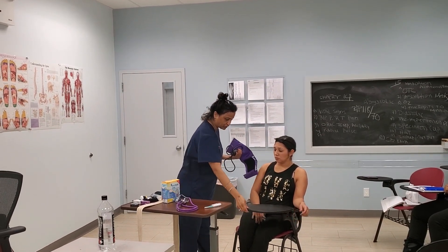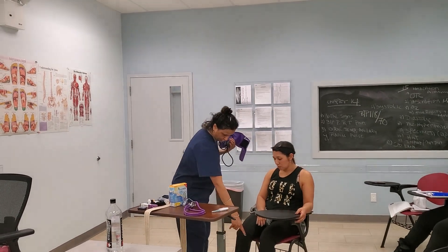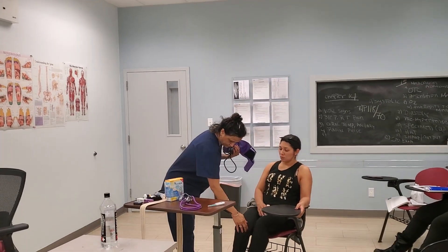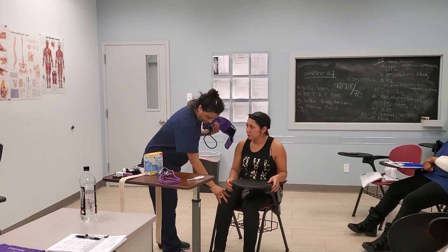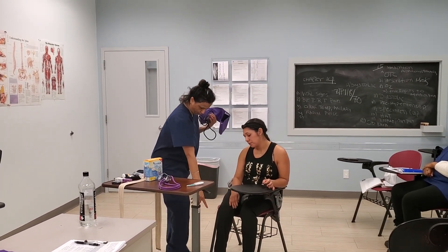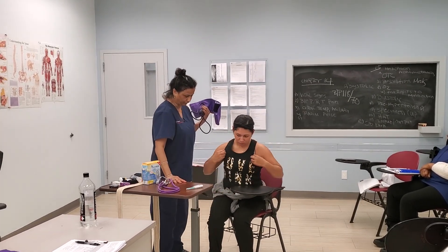It's important that I have my patient positioned in a very comfortable place. Don't cross your legs, Yolanda — make sure your legs are firmly on the floor. Yes, feet must not be dangled. When checking someone's blood pressure, ask: do you have any history of hypertension?